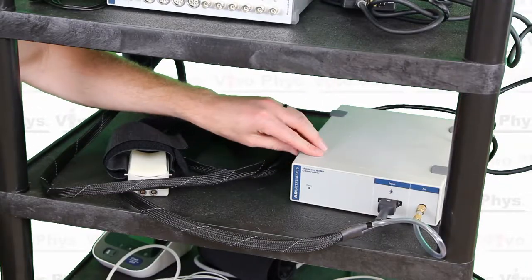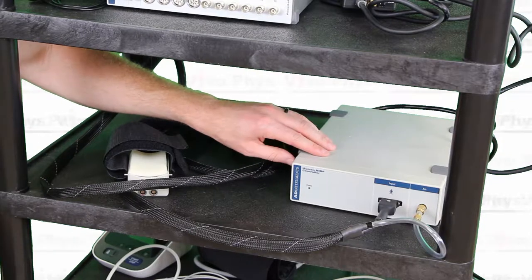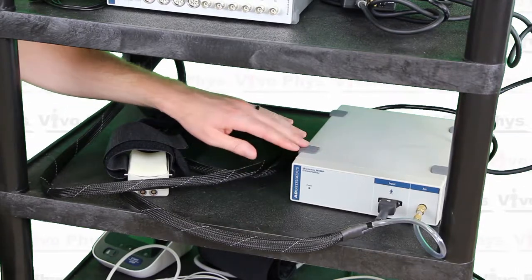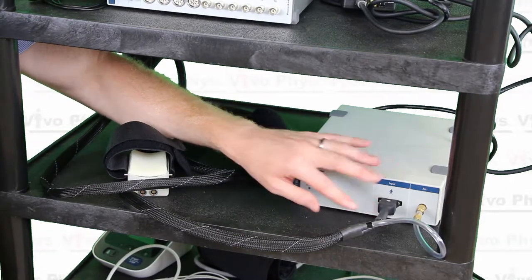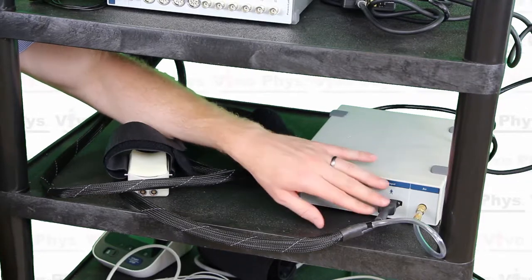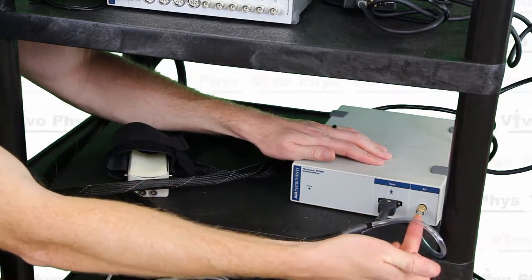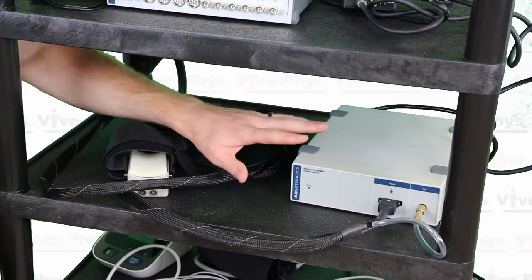This is the ADInstruments human NIBP device. NIBP stands for non-invasive blood pressure, so this is the finger cuff blood pressure device we'll be using today. You can see there are a couple of different connections on the front: one with a digital connection where the power comes from, and another with a clear plastic tube where the air source comes from so we can get the blood pressure measurements.